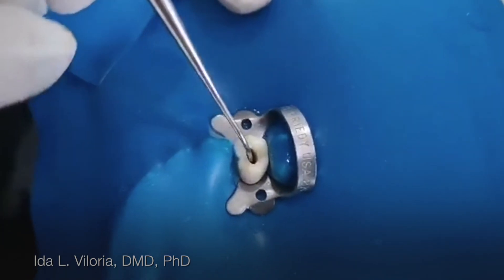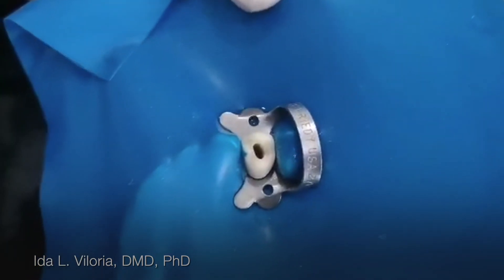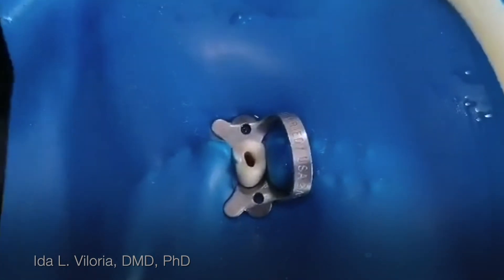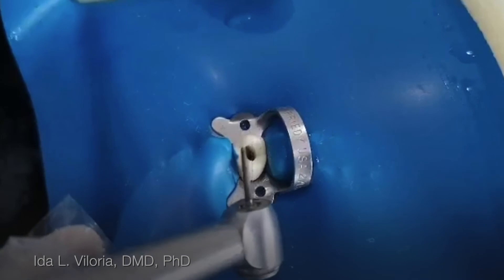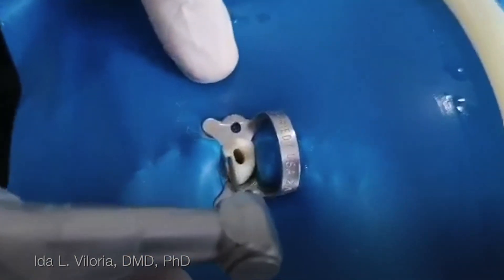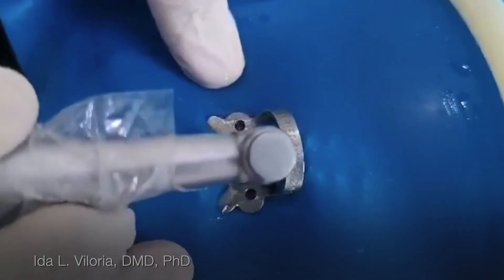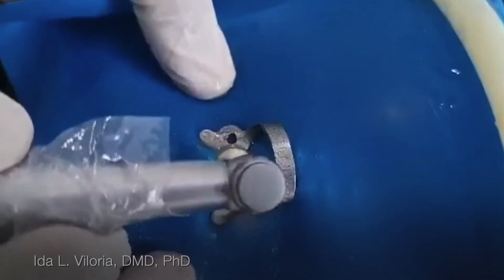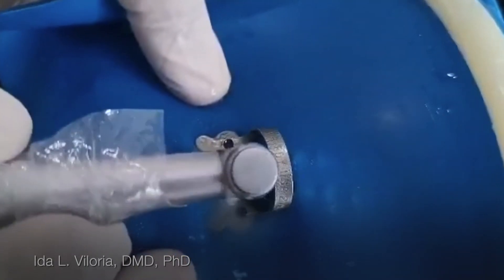Now I'm ready to do the finishing of the walls using the long-tapering fissure burr. So this is it. I'm going to finish it. Smoothing the walls. Then also at the same time, you diverge the walls towards the occlusal.